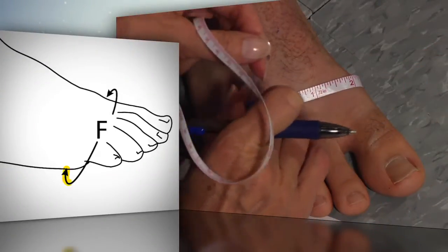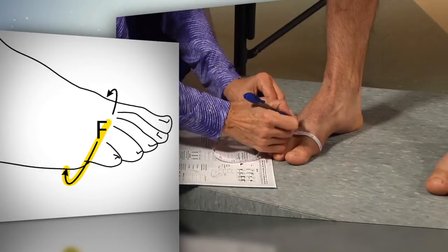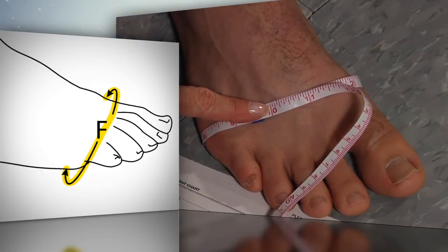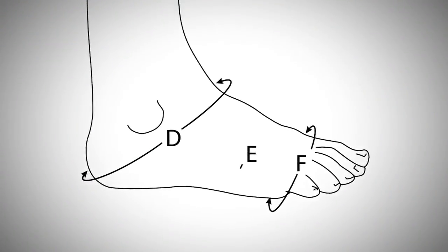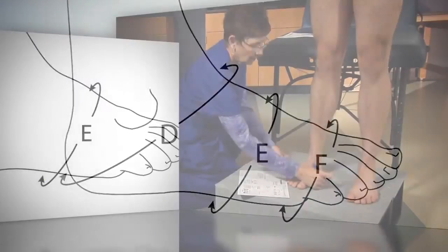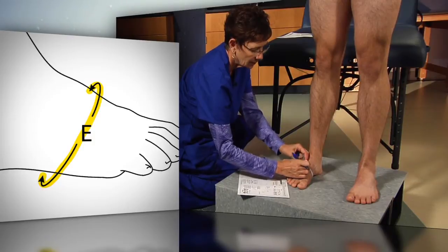Wrap the retractable tape around the metatarsal heads and make a mark on the foot to indicate the location of the measurement. This is circumference capital F. Find a point about halfway between the two marks made for capital D and capital F, and make a mark on that location. This is where circumference capital E will be taken.